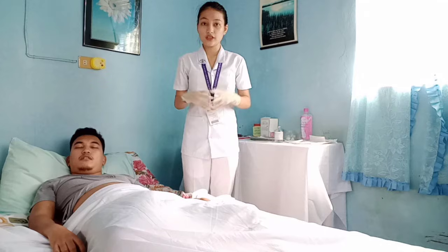Now place the patient in a comfortable position and document the procedure. The last procedure is the intramuscular injection. Intramuscular injection is the introduction of medication deep into the muscle tissue where a large network of blood vessels can absorb it readily and quickly.